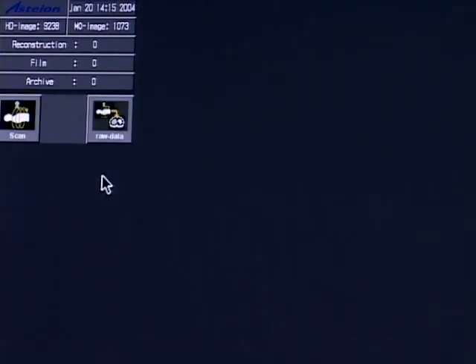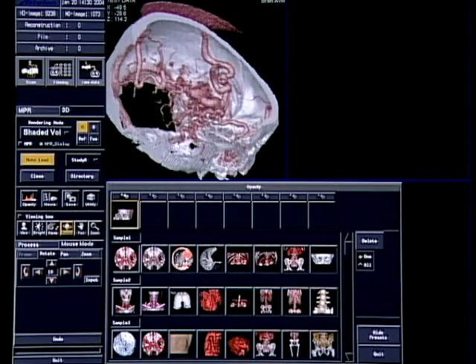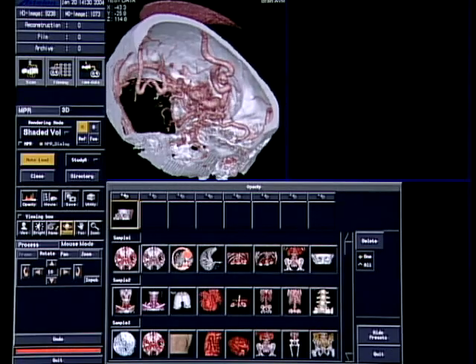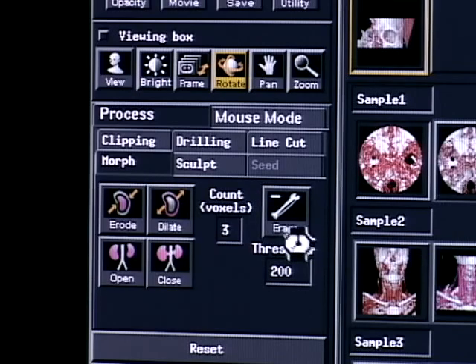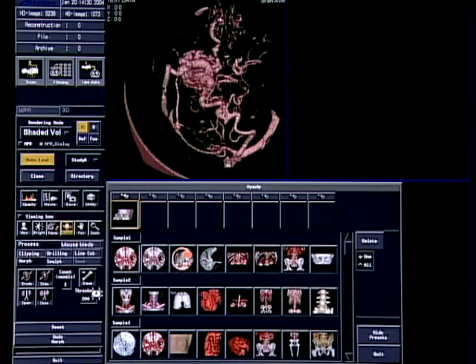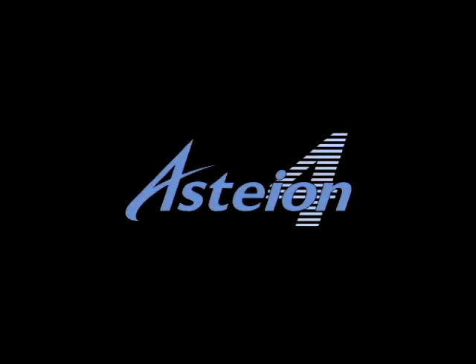3D images can be generated easily. Image rotation is smooth and quick. The elimination of bones and unnecessary parts is also simple. Astian Super 4 is an ultramodern system that enables sophisticated CT examinations to be performed simply and quickly.